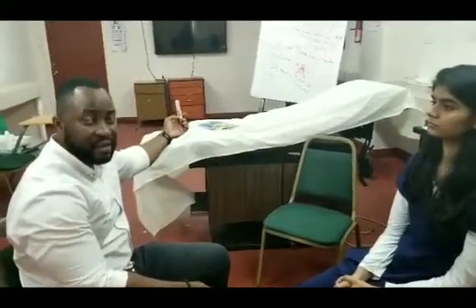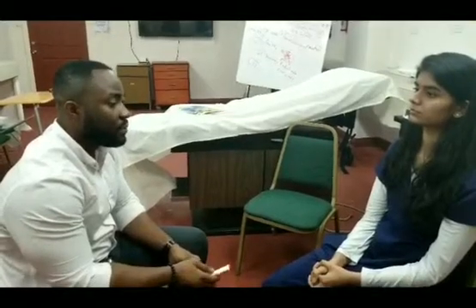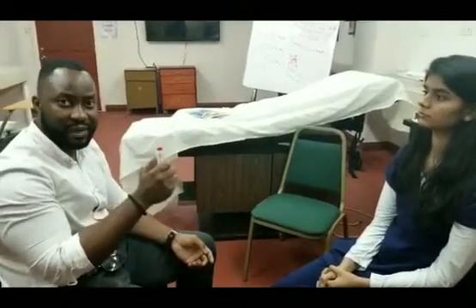Scanning from the side, I check for the red reflex, and normally I would see a reddish orange background. The next thing I want to do on the fundoscopy is to make sure I'm holding the ophthalmoscope the right way. If I'm looking at the right eye, I'll hold my ophthalmoscope with the right hand, and if I'm looking at the left eye, I'll hold it with the left hand.